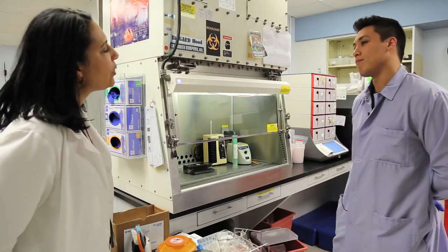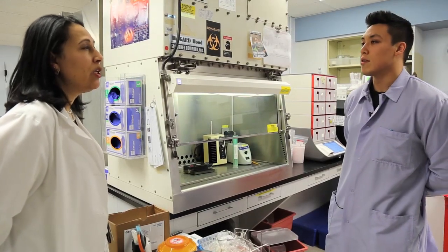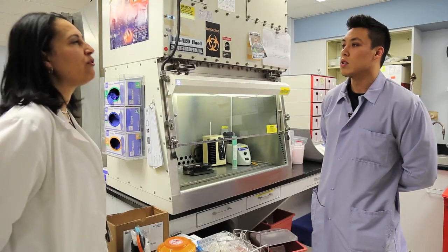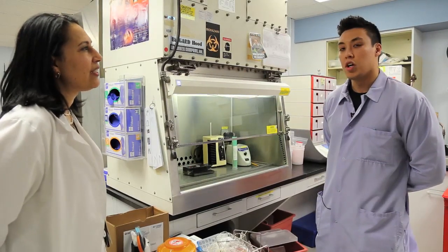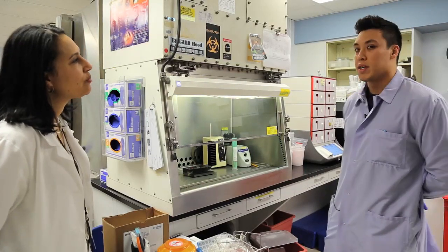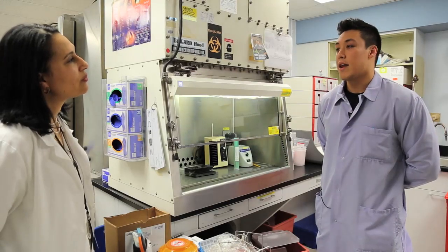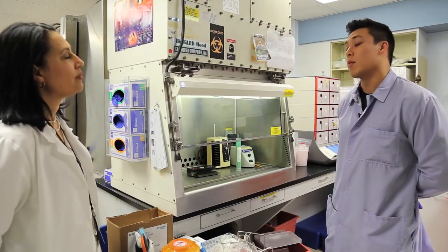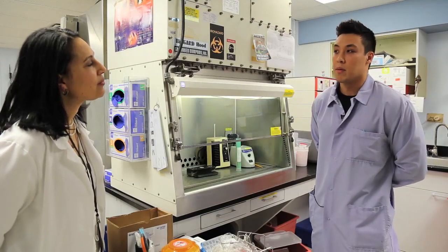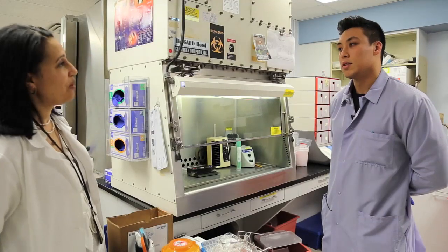Okay. So my understanding, though, also is that with the blood BioFire, you can also detect sometimes certain organisms that have certain drug resistance, correct? Sure. One bit of technology that this instrument and this system offers is that they do detect genes that have resistance mechanisms in some organisms. Of course, this is always confirmed with other biochemical and culture method testing as well. Okay, and that's very, very helpful for us.